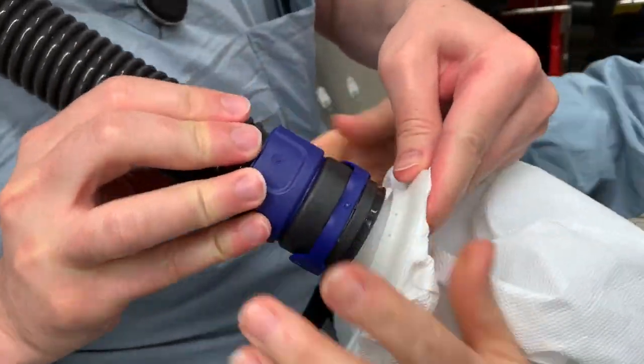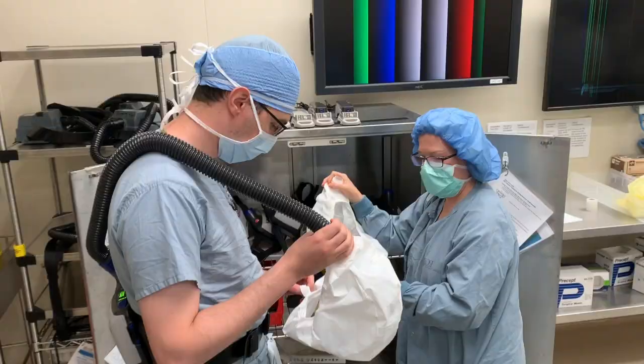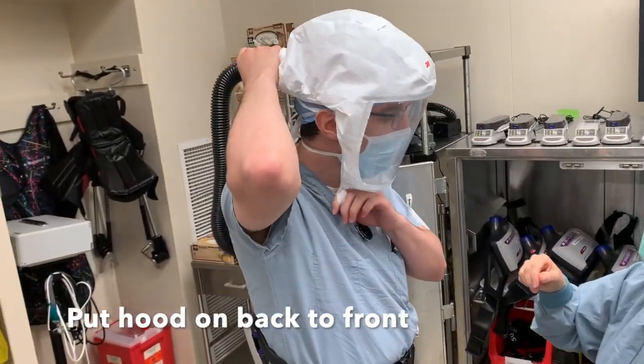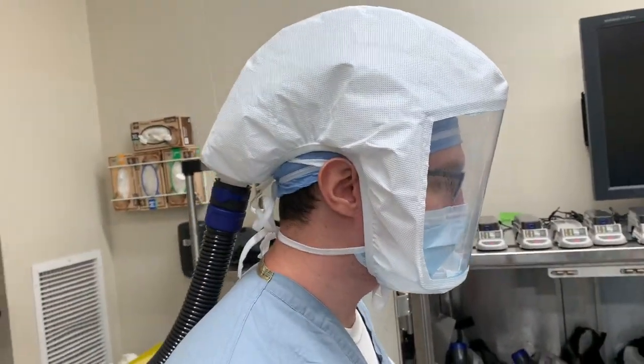You then attach the hose to the hood. You remove it by pressing on this blue area here. You then need to put the hood on back to front without touching the inside. The hood will not cover your ears — it should be sealed around your face.